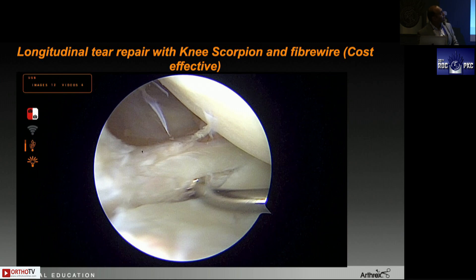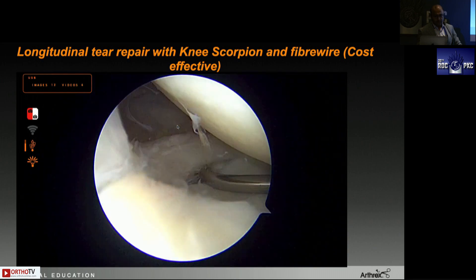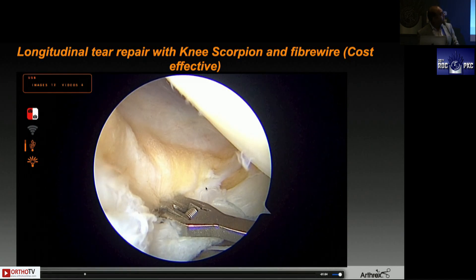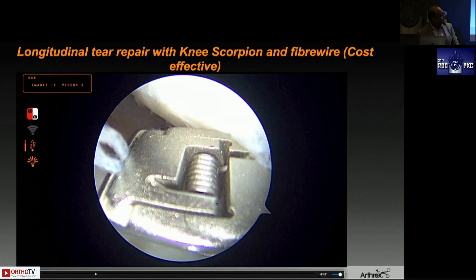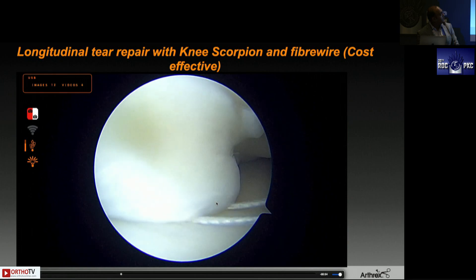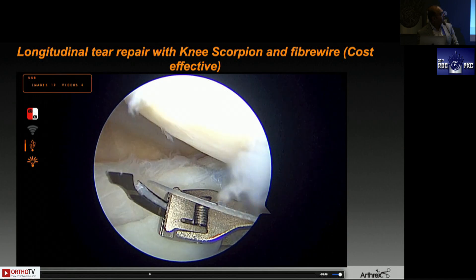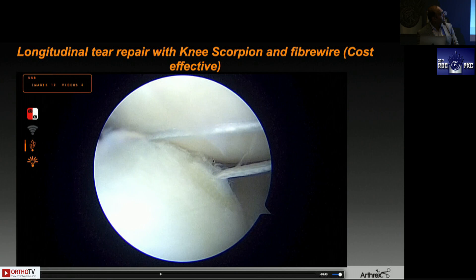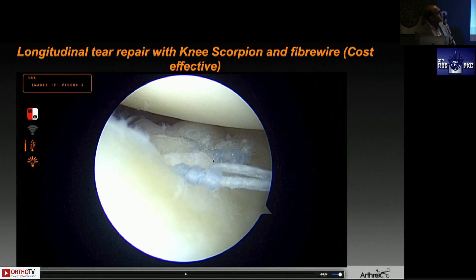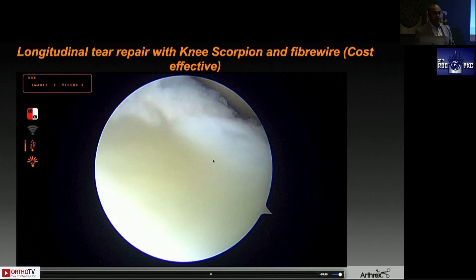The knee scorpion works wonders because you are nowhere near the capsule. You are preparing the surfaces, rasping, using a small joint shaver blade. Now coming with the knee scorpion, taking a bite through the superior surface — the trick is to identify the suture from the rent in the longitudinal tear and load the inferior suture again onto the scorpion. You get a nice vertical mattress configuration. You can see one suture has already been placed — very cost-effective and very safe because you are not putting any devices near the capsule or root.